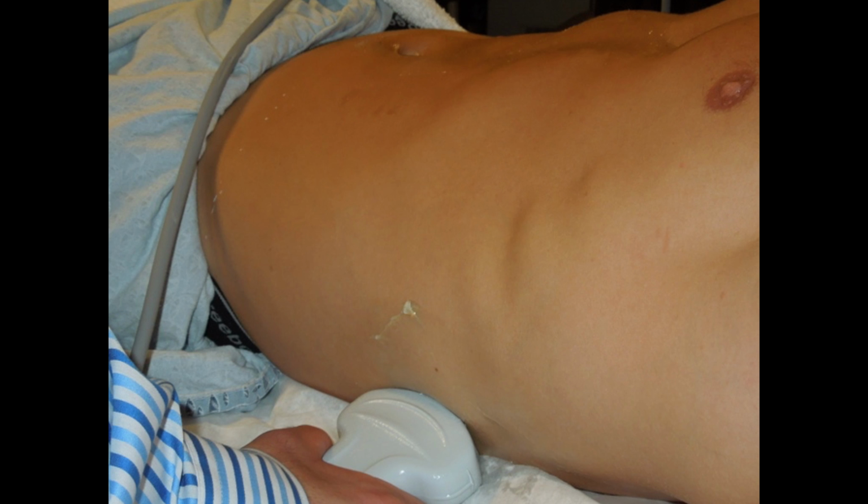This is your probe. It's going to be usually more superior and posterior than the right upper quadrant. Oftentimes your hand will be on the bed. As you can see here, it's laying right on the cot.